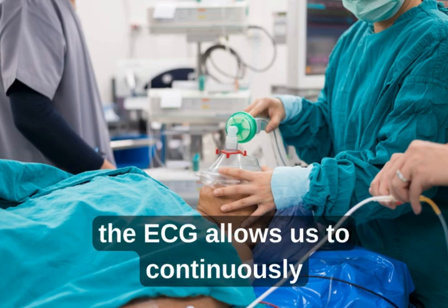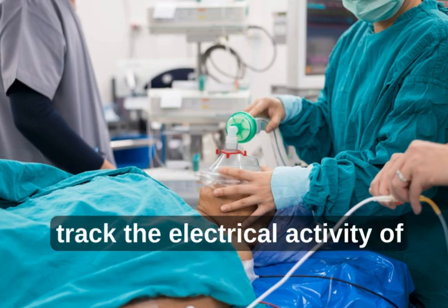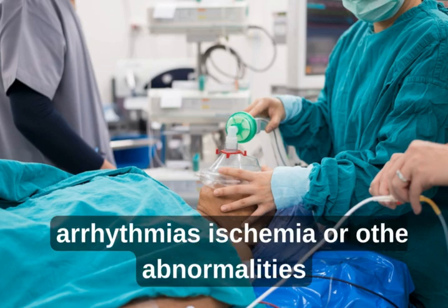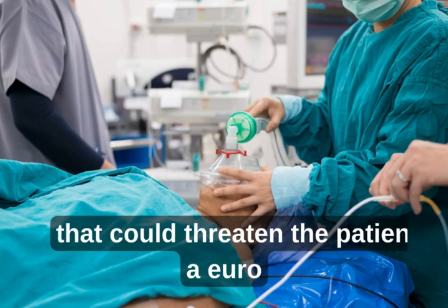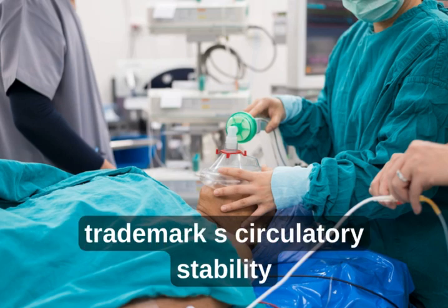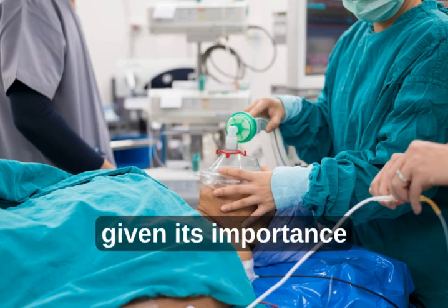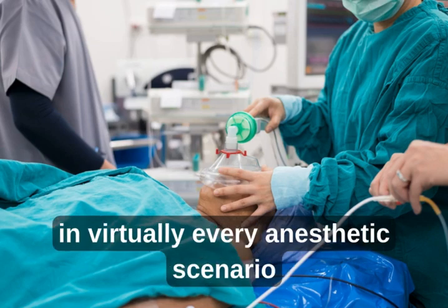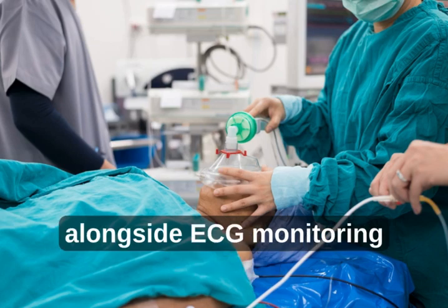The ECG allows us to continuously track the electrical activity of the heart, helping us detect arrhythmias, ischemia, or other abnormalities that could threaten the patient's circulatory stability. Given its importance, the ECG is the first line of monitoring in virtually every anesthetic scenario.